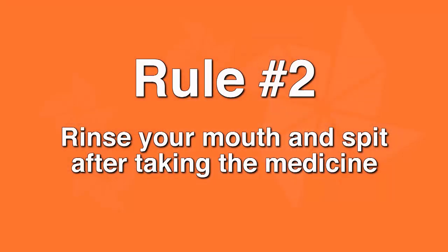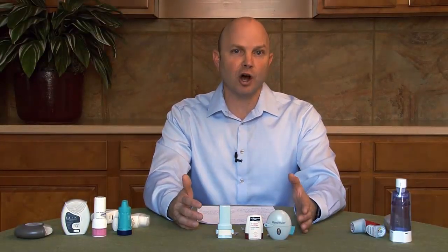The second general rule is to always rinse your mouth and spit after taking the medicines. This applies most to the inhaled steroids, where those medicines can cause an infection in your mouth. Those steroids, if you swallow the rinsing solution, might also cause side effects. So again, it's a lot to remember which medicines you need to rinse your mouth for, and as a general rule, it's a good idea to always rinse and spit after taking all your medicines for the day.